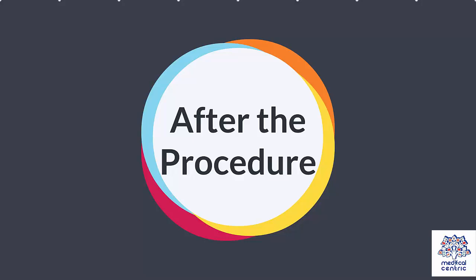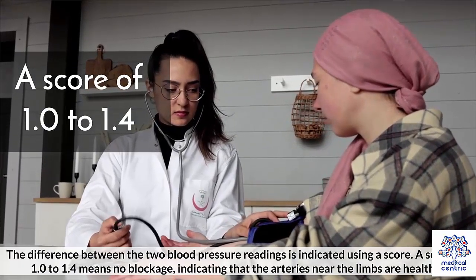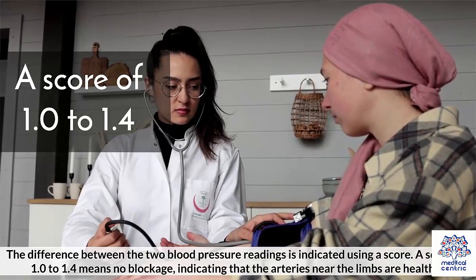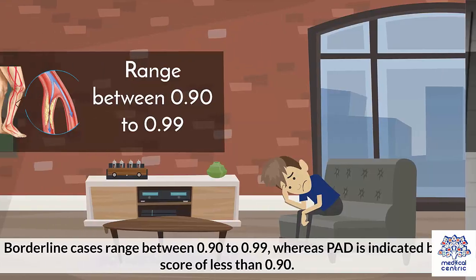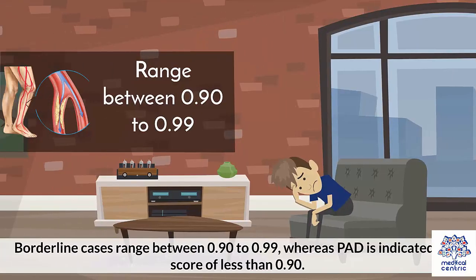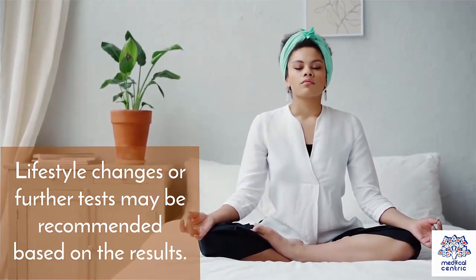After the procedure: The difference between the two blood pressure readings is indicated using a score. A score of 1 to 1.4 means no blockage, indicating that the arteries near the limbs are healthy. Borderline cases range between 0.90 to 0.99, whereas PAD is indicated by a score of less than 0.90. Lifestyle changes or further tests may be recommended based on the results.